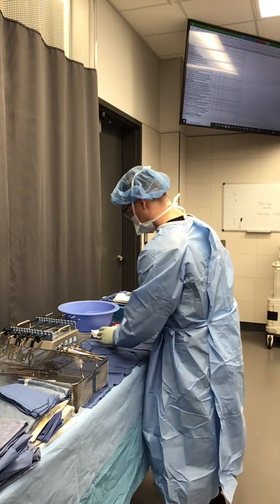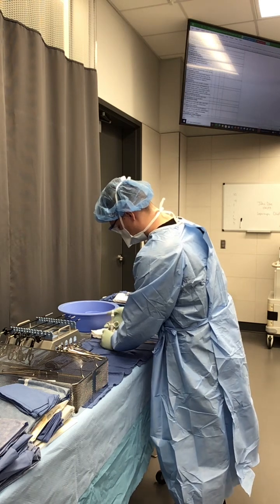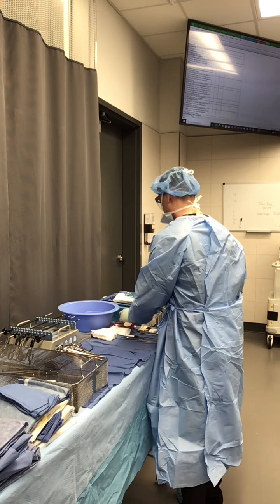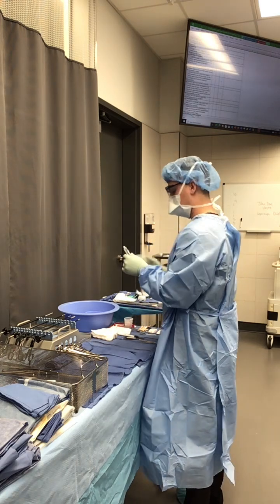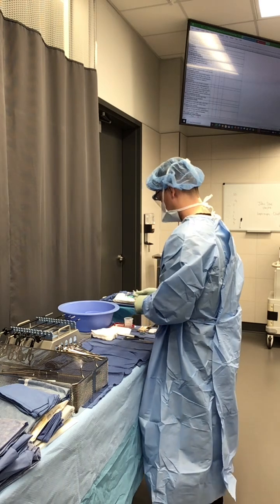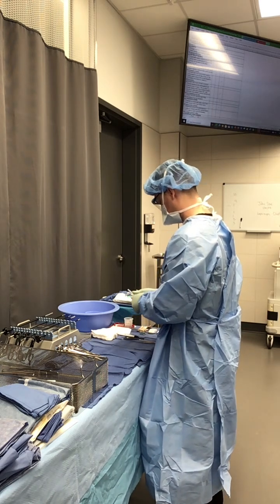I'm going to fill up my syringe to ten milliliters. I like to put my med cup in the magnet portion too, just in case it spills a little bit — I have that there to hold it in place. All right, my lidocaine is ready.